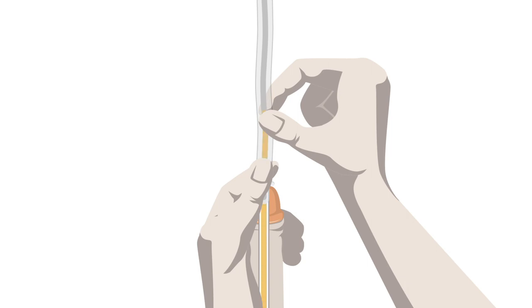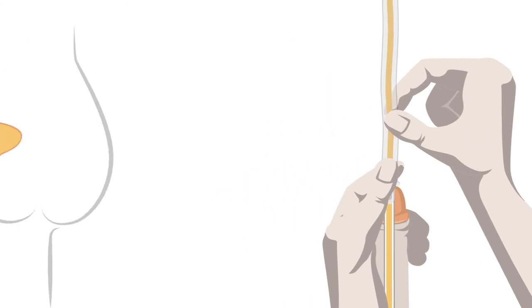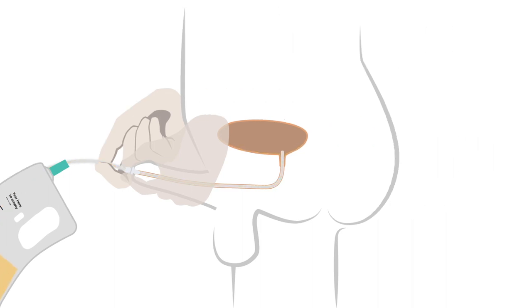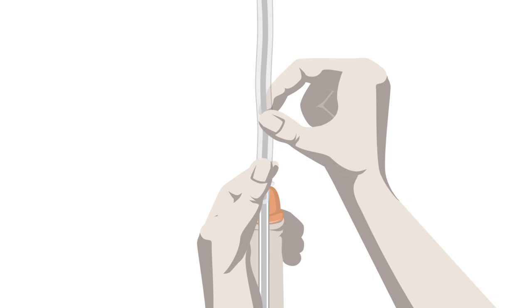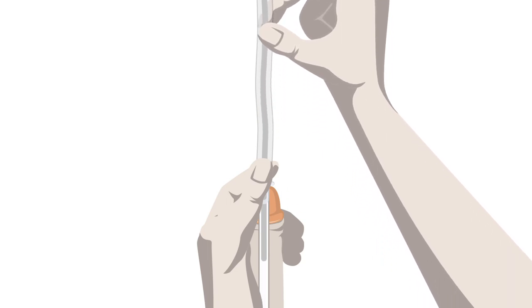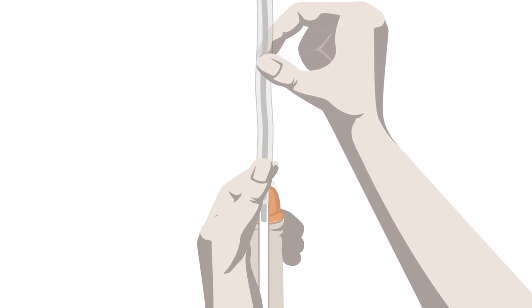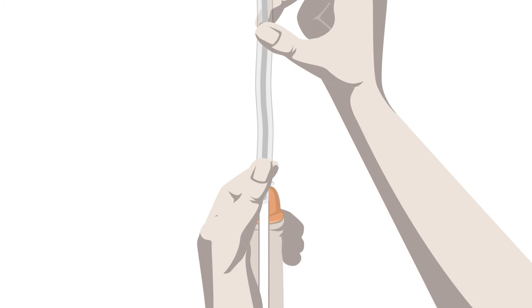As the catheter enters the bladder, you will see urine flow into it. Continue to hold it in place. Observe the urine draining into the integrated collection bag, making sure that the bag is supported as it fills. Once urine flow has stopped, slowly withdraw the catheter. If urine flows again, pause until it stops. Once you're sure the bladder is empty, remove the catheter completely.